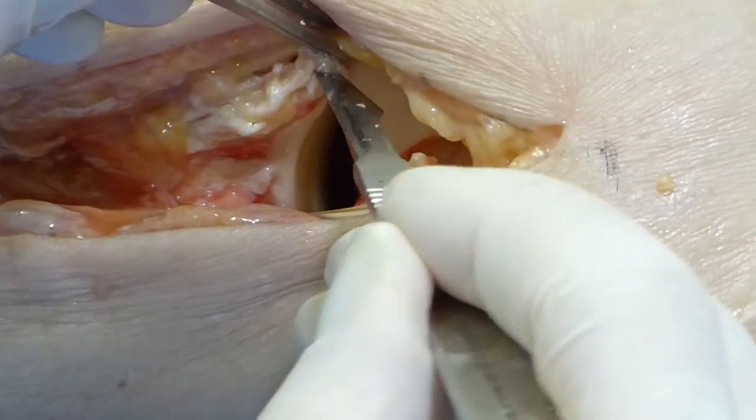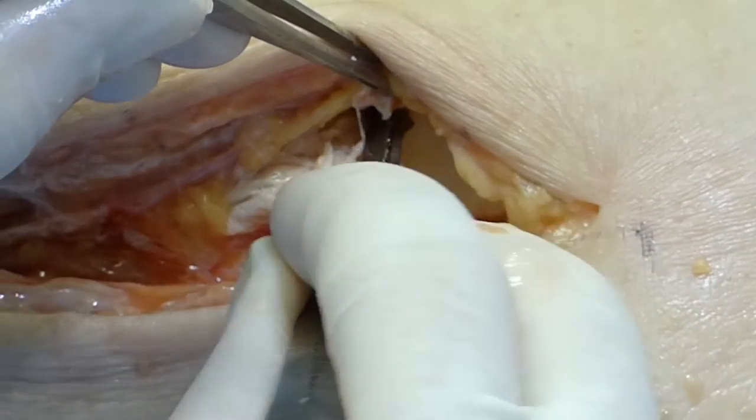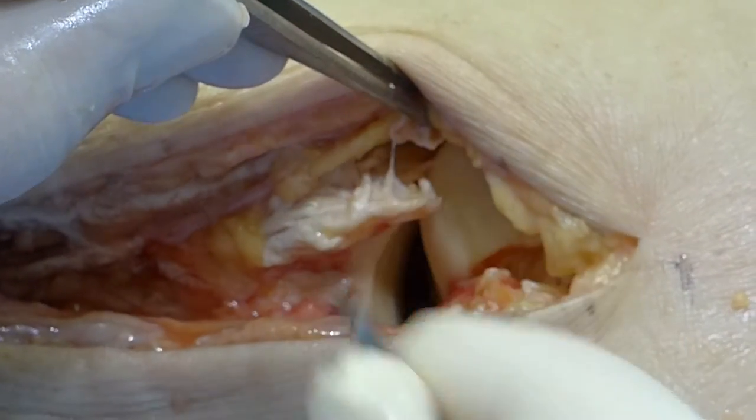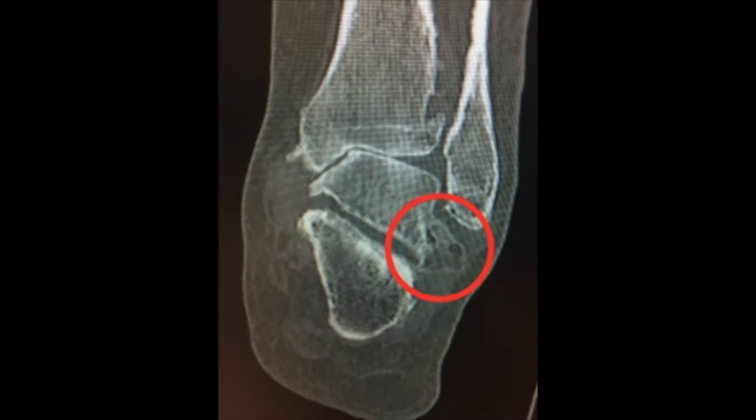Dissection then proceeds anteriorly to allow removal of anterior osteophytes often present in tibia talar osteoarthrosis. These should be removed when attempting to correct an equinus deformity. Any large osteophytes on the lateral process of the talus should be excised to leave a flat surface; these osteophytes are particularly common in varus osteoarthrosis.